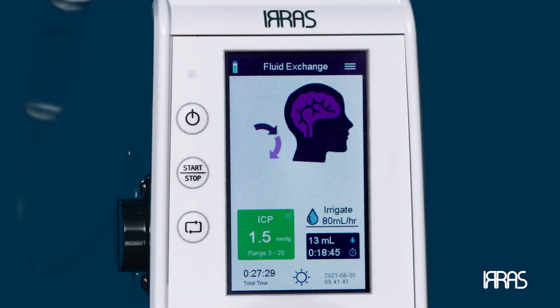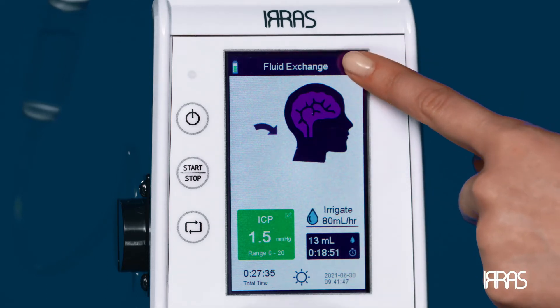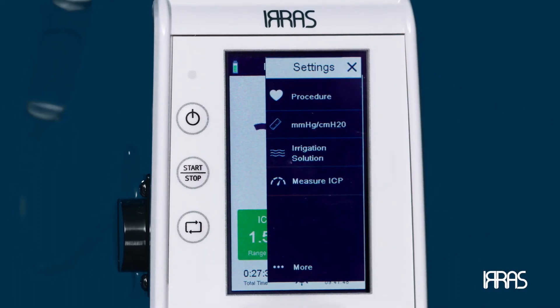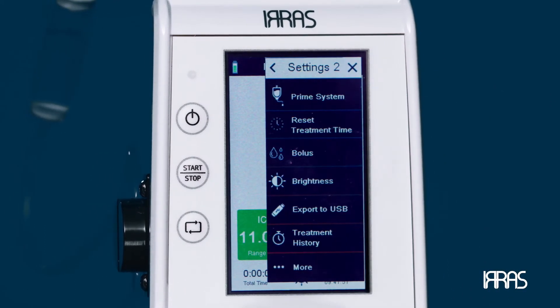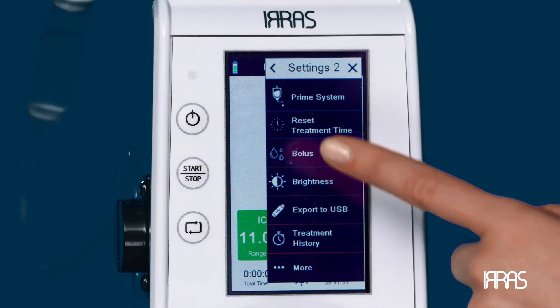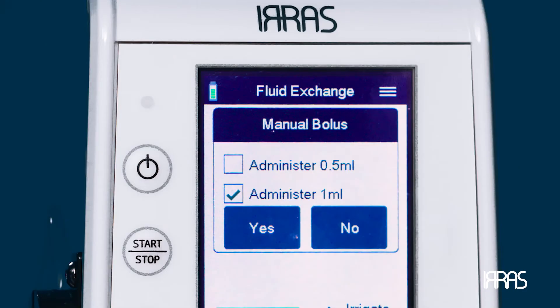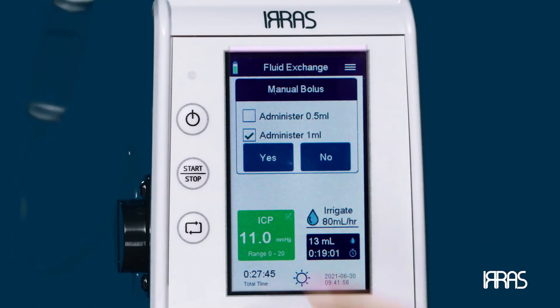You can also deliver a manual bolus through the control unit settings. Press the settings menu and select the bolus option. Choose between a 0.5 or 1 milliliter bolus, confirm your selection, then press yes.